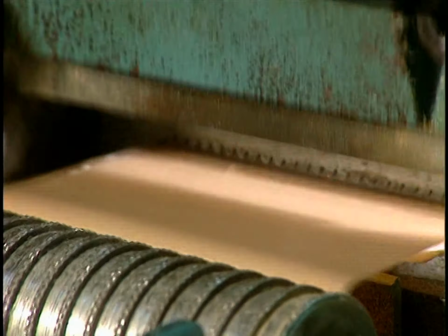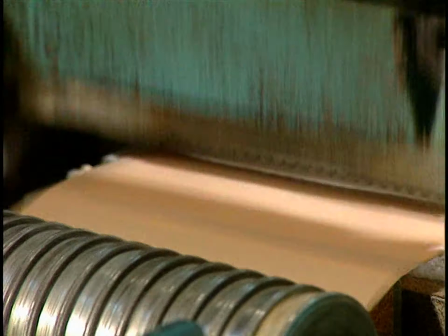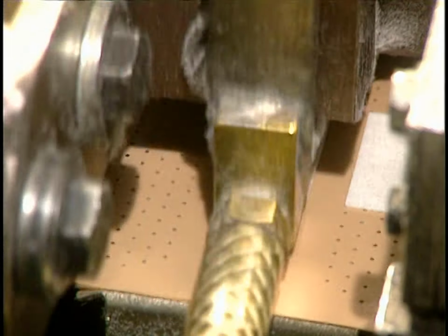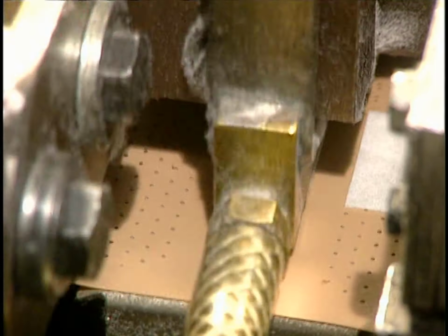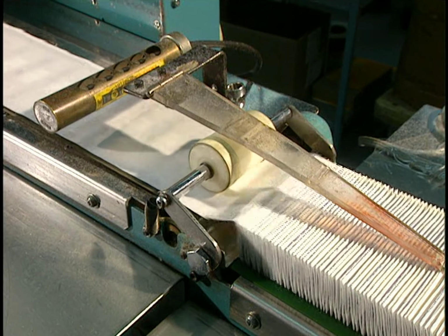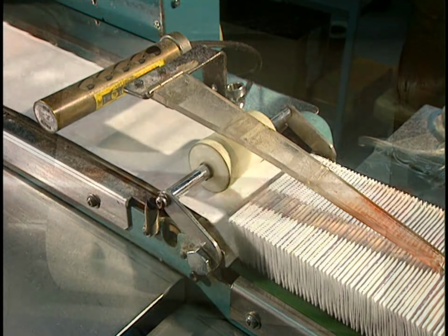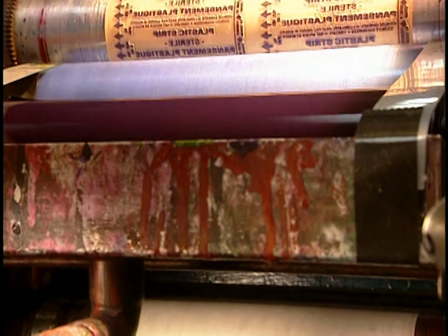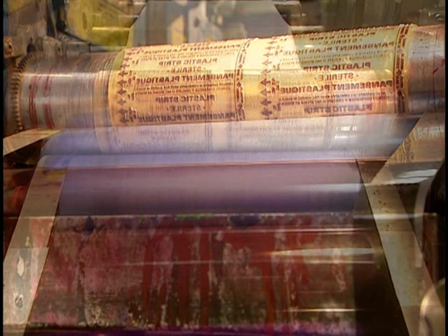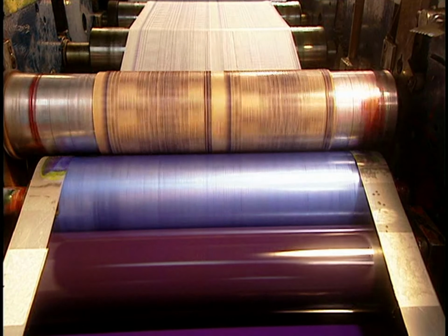Certain types of bandages have to go through a sequential bandage machine to have aeration holes pierced in them. These holes allow air to circulate and thus help promote healing. These bandages are now ready. Sometimes they print instructions on bandage wrappers. This paper printing machine is used with bandage machines.